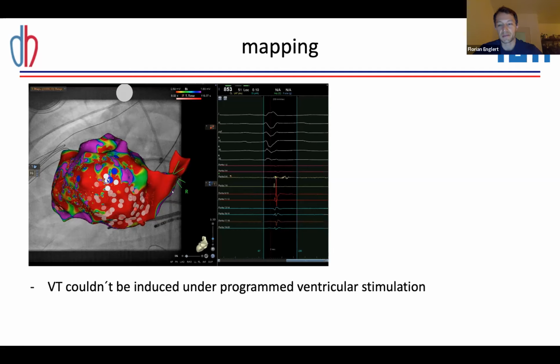You can see it pretty well in the inHEART, but while mapping, it was not easy to differentiate, and also there were many extras coming while mapping with the PentaRay, so it was hard to get clean signals there.